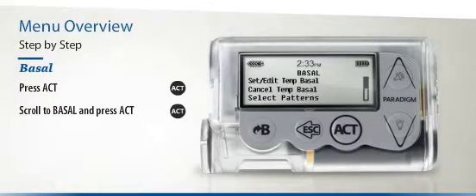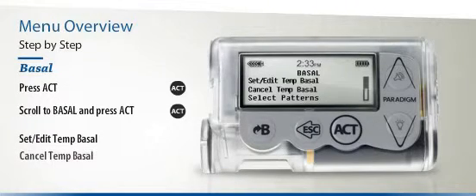Depending on which functions are active, the Basal menu will include Set Edit Temp Basal, Cancel Temp Basal, Select Patterns, and many more.